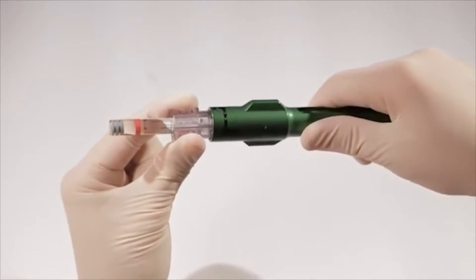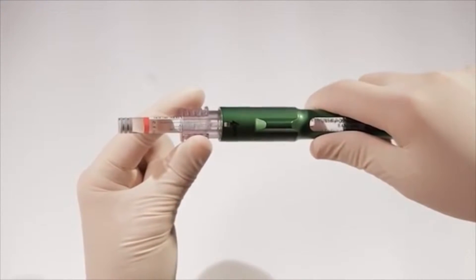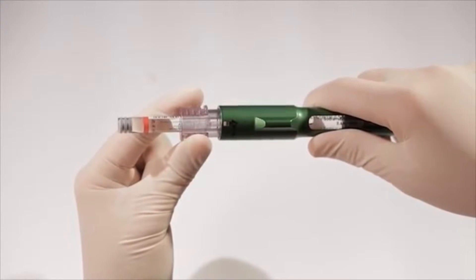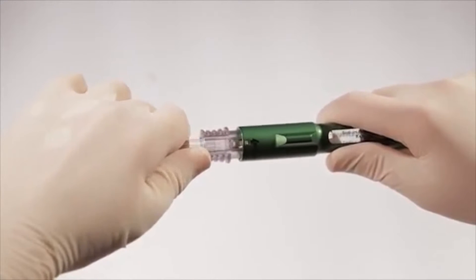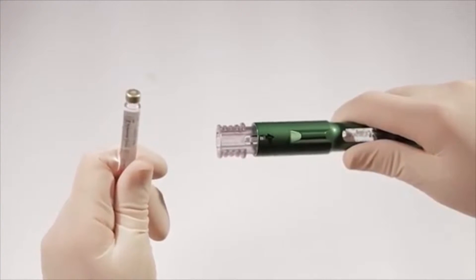Second, turn the connector counter-clockwise approximately one quarter turn back to the number one position. This unlocks the 1.8-milliliter cartridge from the connector. Grasp the 1.8-milliliter cartridge and pull it straight out from the connector. The connector remains in the pen at the number one position.